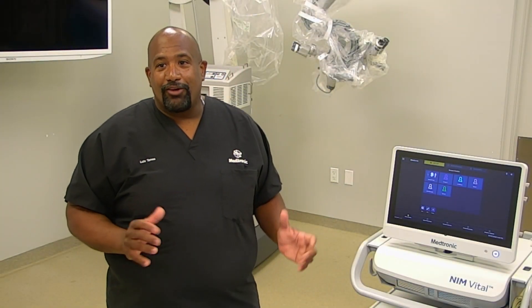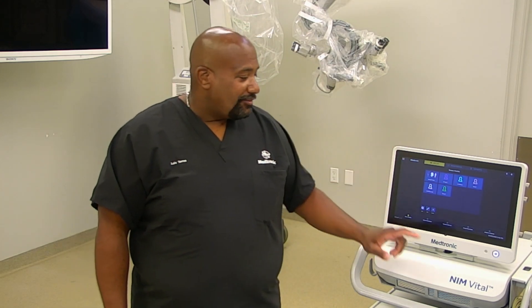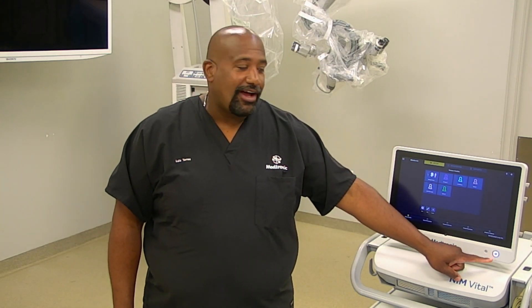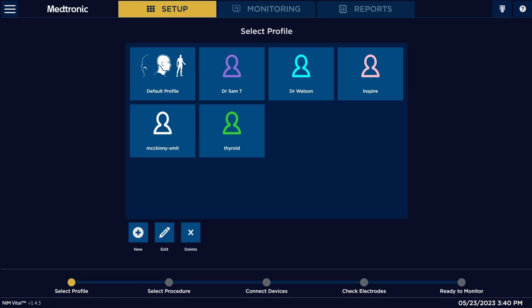This will be a short NIM Vital quick start video. Once you first turn on your NIM Vital, you use this button here on the bottom right-hand corner to turn it on. It will come up to this main screen here.